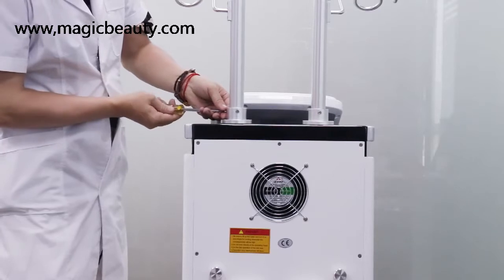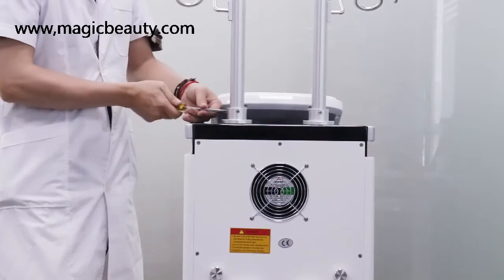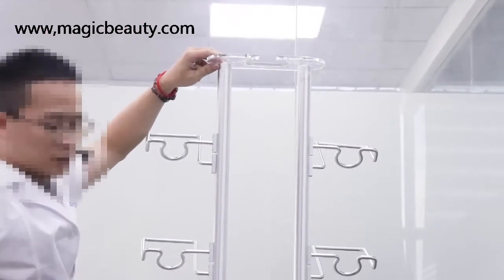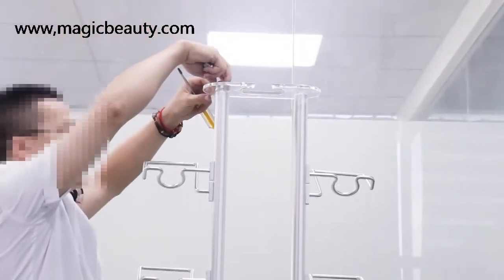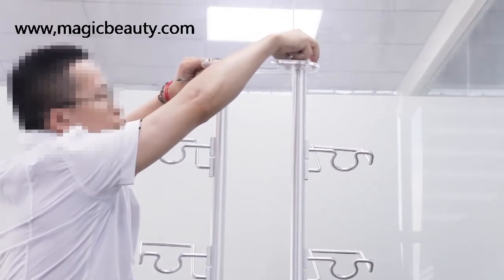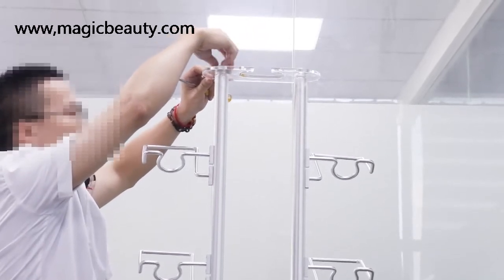After we fix the handle holders, the second thing is we need to fix the plastic holder — this is for the double chain holder. We put it over here, and you will see there are two screws to fix on the top. So on the top, we fix the plastic holder for the double chain holder, the smallest handle.